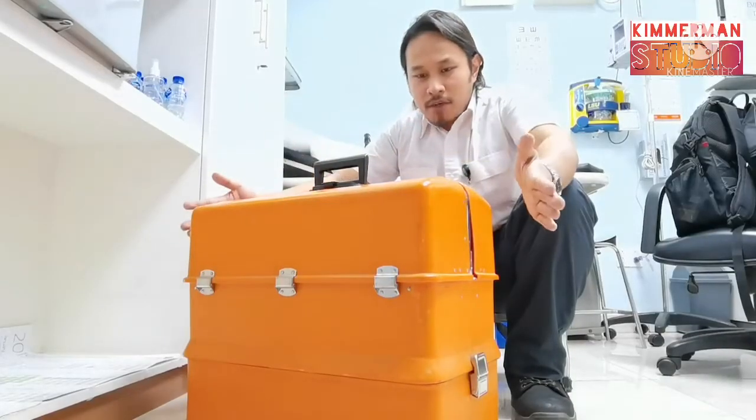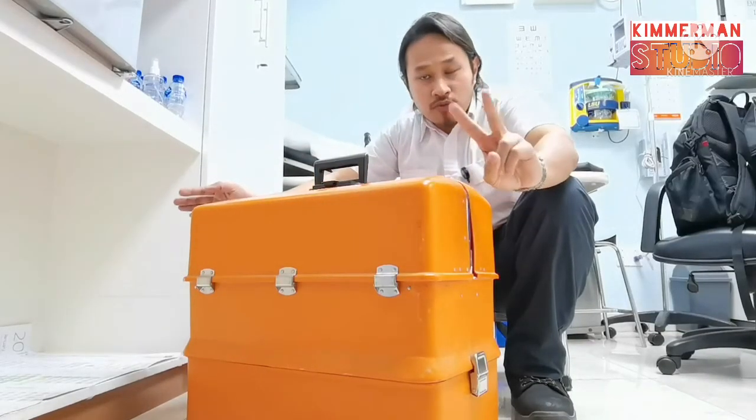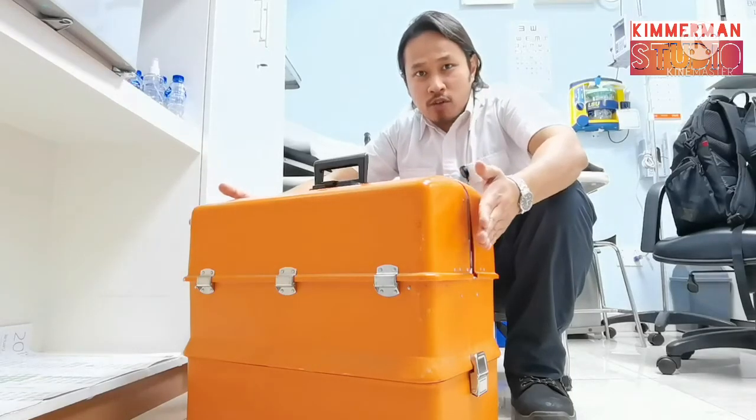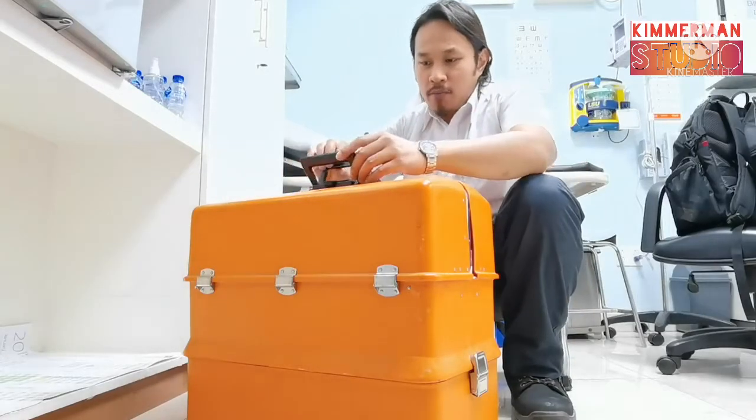So this disaster box can accommodate two victims. And every week we check this for its completeness. So we will open this now.